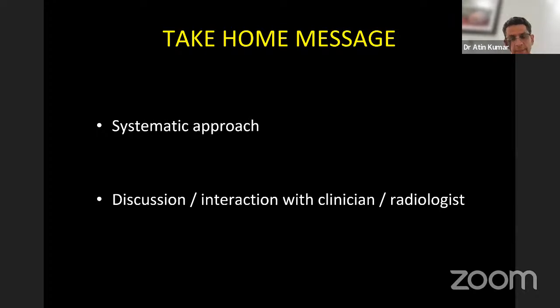Ultrasound is the bedside modality. There's no harm in doing the ultrasound. You can pick up the periventricular flares. You can look at the cystic changes, periventricular leukomalacia. You can detect the hemorrhages. You can follow them up also. But sometimes the subtle changes ultrasound will not pick up and may not pick up in the very early stage also. Or if it is remote, if it was a hemorrhage which was remote, ultrasound will not pick up. Then you may require MR to be done.